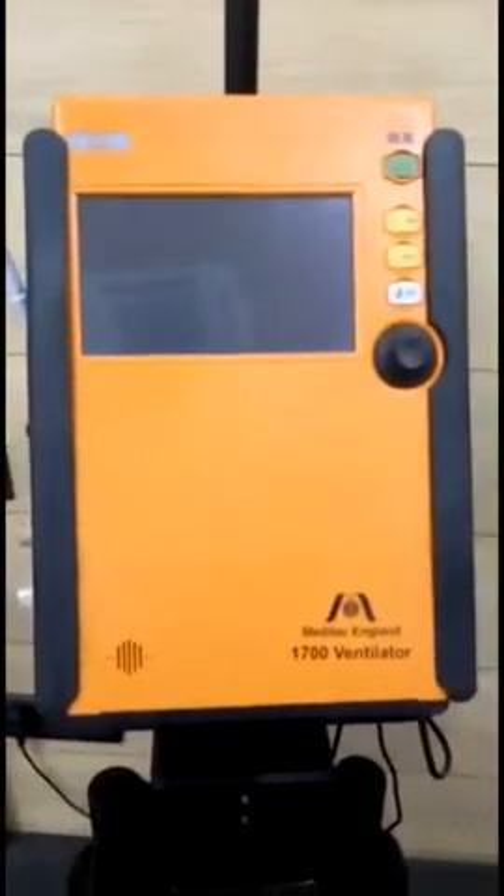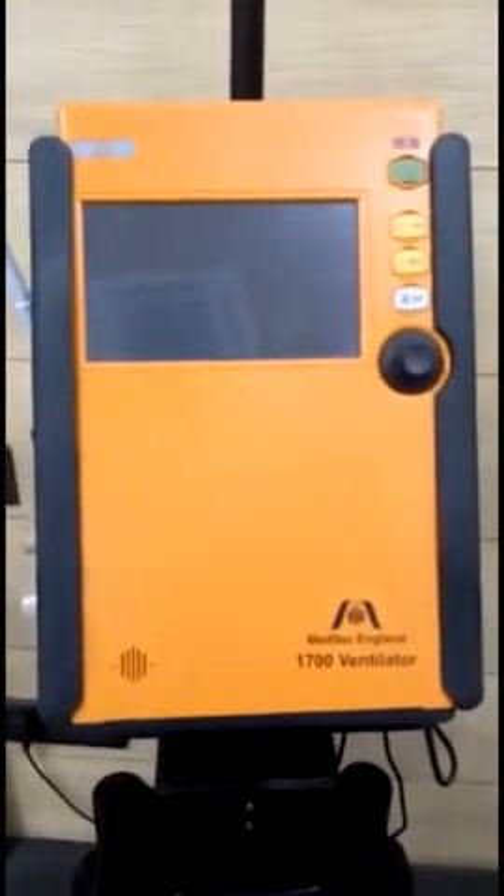This is the Meditec England 1700 ventilator. This ventilator can be used for both transport as well as for ICU purposes.